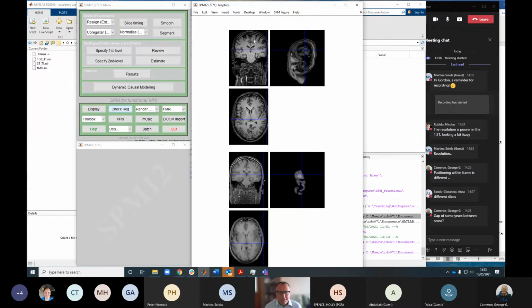It's a bit like a Lego brick. In our image, we've got our three-dimensional matrix, and each one of those you can think about as a little Lego brick, and the brightness of that Lego brick is given a number, and then we test to see if that number in that location is bigger than we would expect at rest, or whether it's the same.